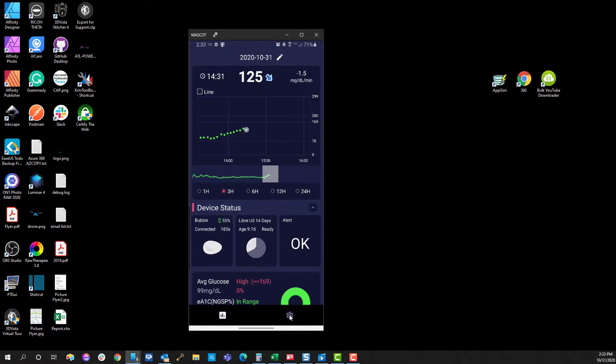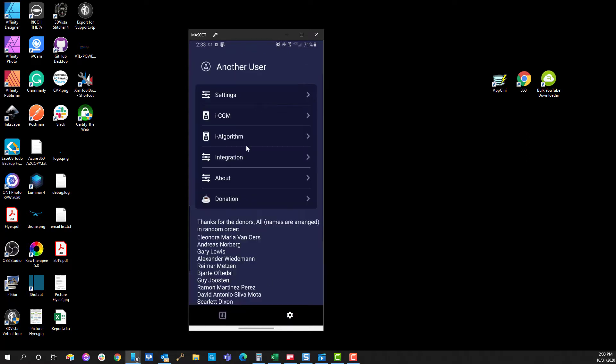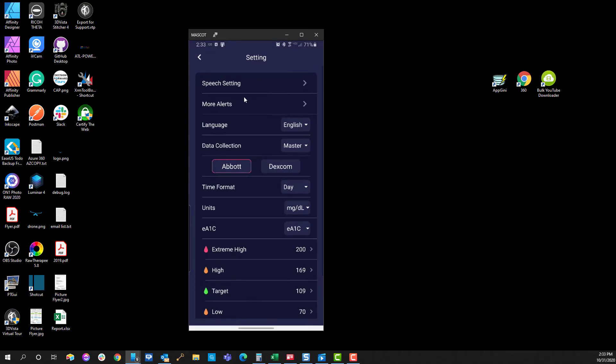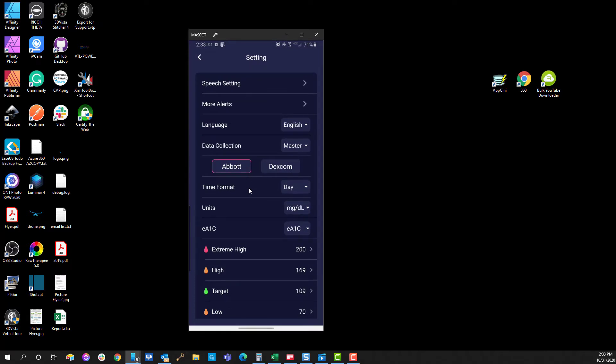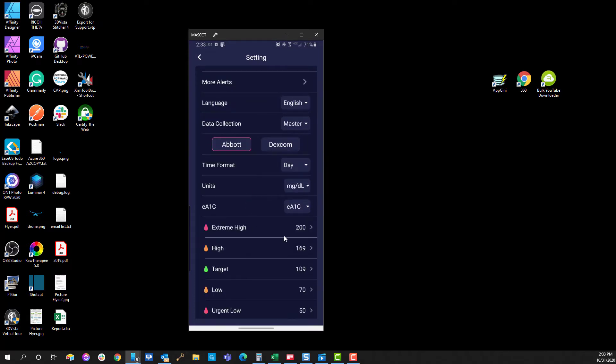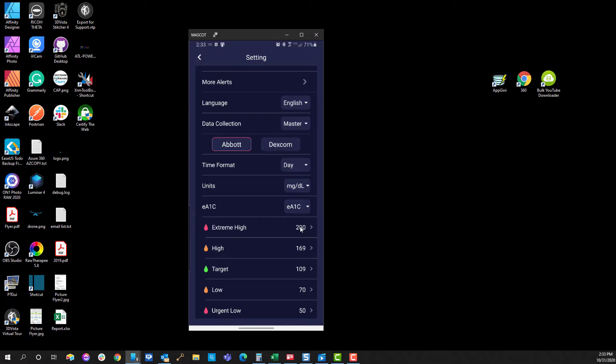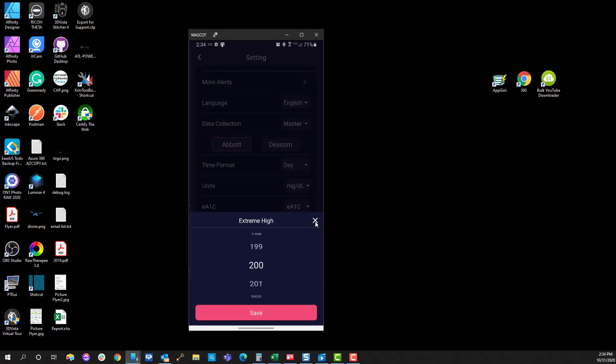The next thing you're going to want to do is come over to the settings and cogs area. We're going to go down through some of these and make sure that these are what you consider to be correct. These are the default settings: an extreme high of anything over 200. For you that may be 300 or 260 or 250 or whatever it may be. You can just click into it, make the changes, and then press save at the bottom. These are the default settings so I'm going to leave them because personally they work for me.